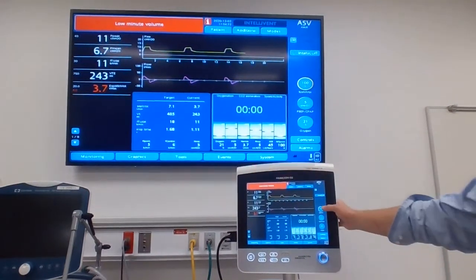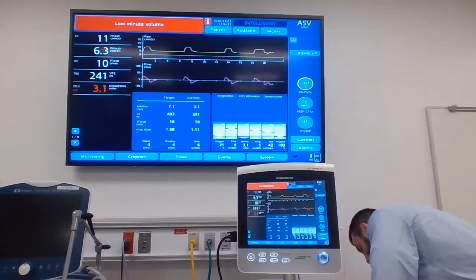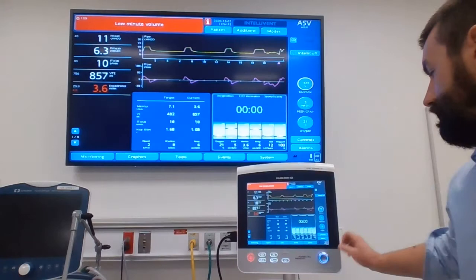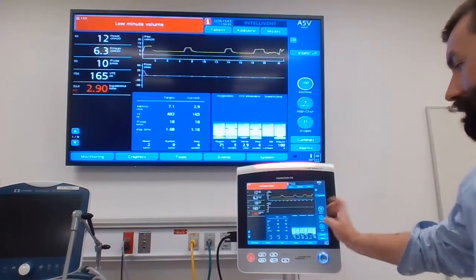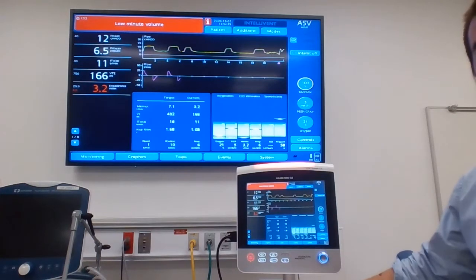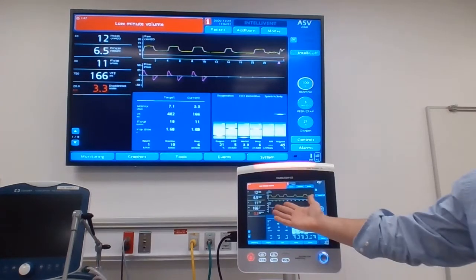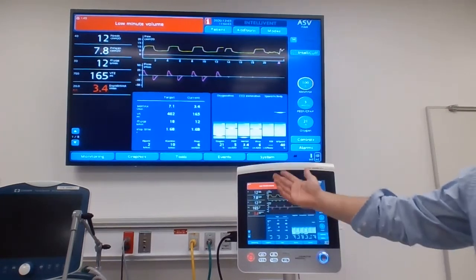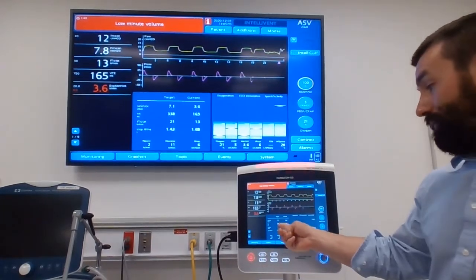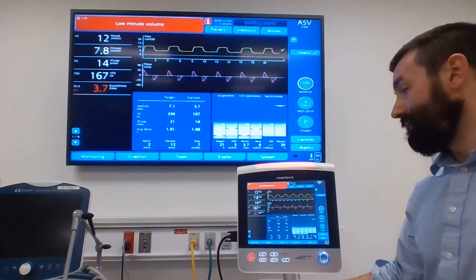So you can see right now, oh, hang on. I've got my lungs set super compliant. It's not really exhaling. So you can see we're targeting a different minute ventilation here now. It's taking a second to pick back up. It's going to go ahead and start adjusting all my settings. My lung was breathing so compliant before. You can see it's taking a little bit with me pulling. It was really, really compliant. So it's targeting this, but we're way low, since it's volume targeted pressure ventilation. So it's going to take a second here.